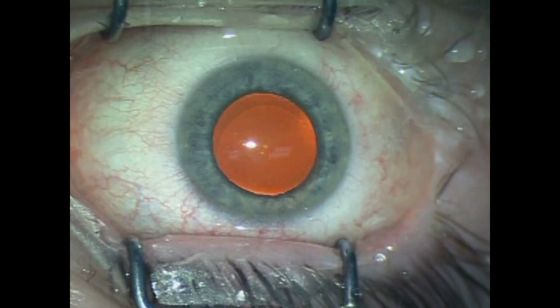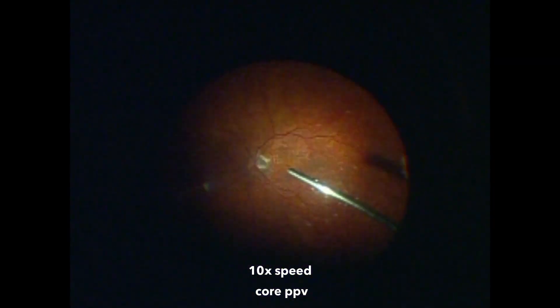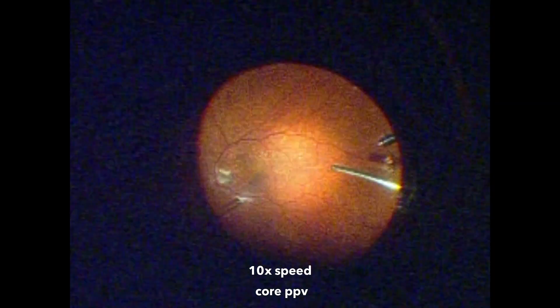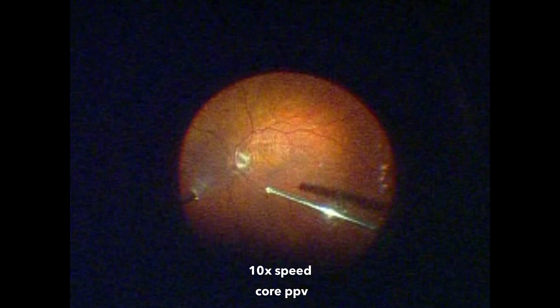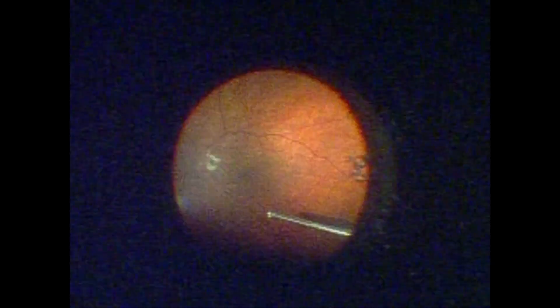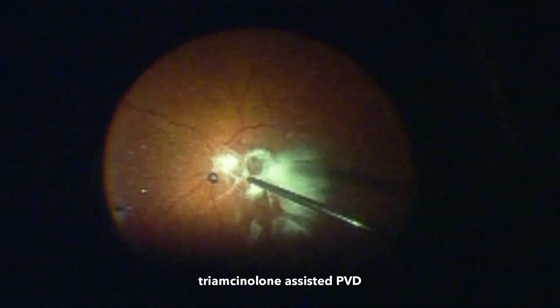25-gauge three-port vitrectomy was performed in the usual manner, followed by core vitrectomy. This patient is only 30 years old and the vitreous is quite dense. It is advisable to remove as much as possible from the central vitreous to facilitate posterior vitreous detachment induction.